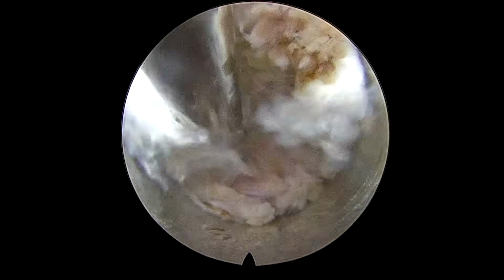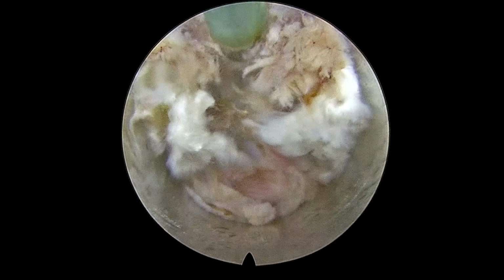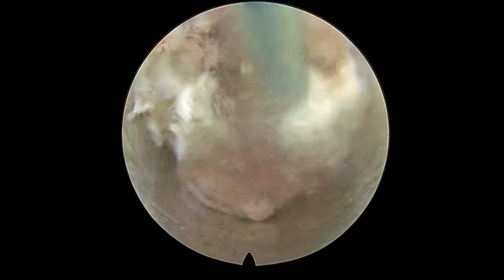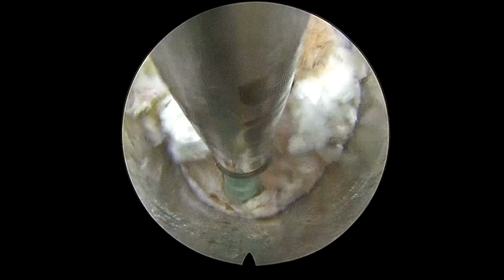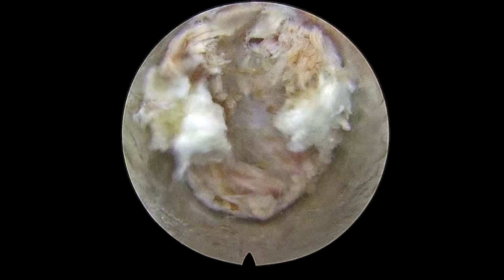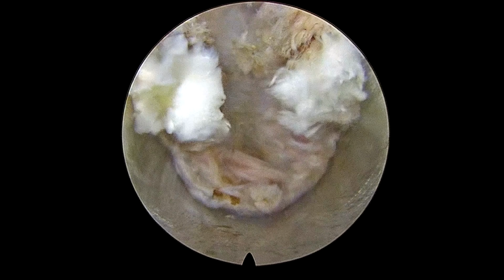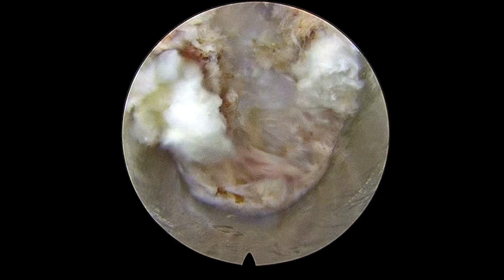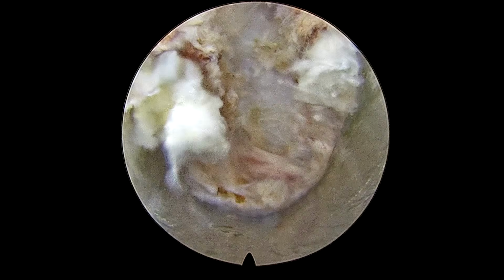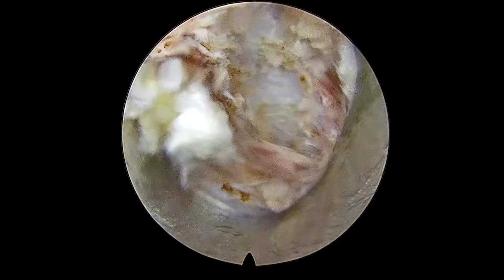So the target at this point is to identify the bony landmarks. The three landmarks which we are concerned about are the superior lamina, then the inferior lamina, and then the lateral mass. So here you can see, let me orient you again. 9 o'clock is cranial, 3 o'clock is caudal, 6 o'clock is lateral, and 12 o'clock is medial. So accordingly we are now trying to locate our bony landmarks here.